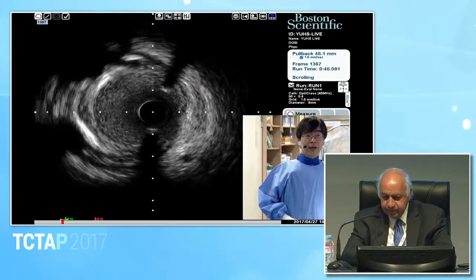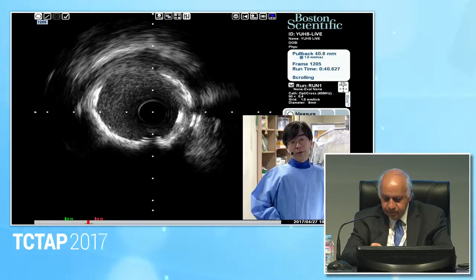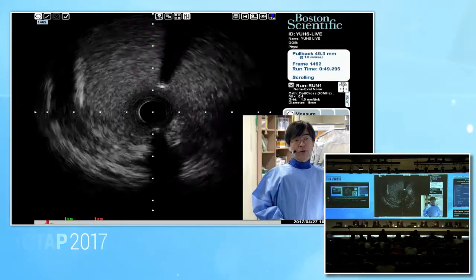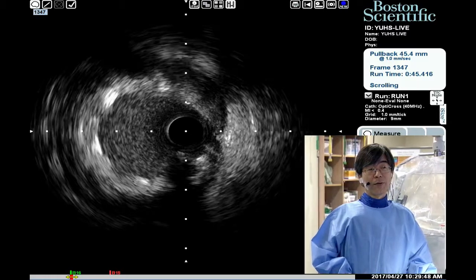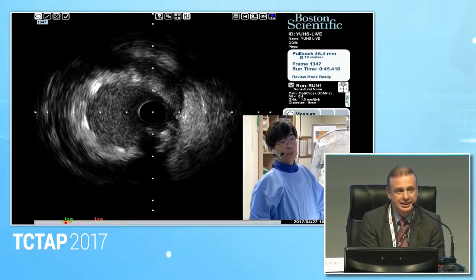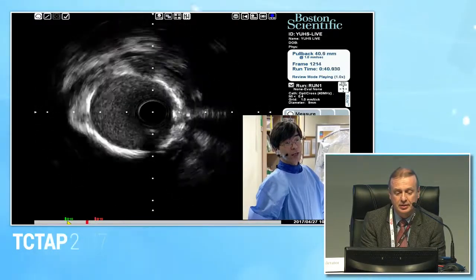Personally, as you know, I strongly believe in the image. Based on the IVUS finding, the proximal left main lumen size is actually quite big. Yeah, but this is our question actually. Do you think maybe you can use a bit bigger non-compliant balloon for the POT technique to optimize the stent, especially in the left main? Tell me about the smallest lumen cross-sectional area in the left main.